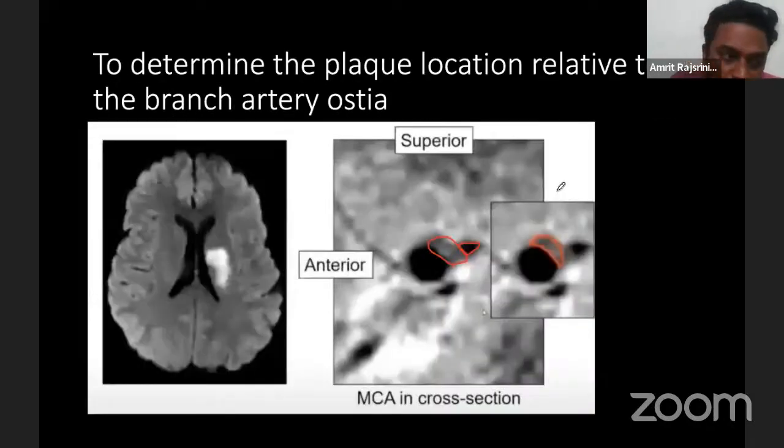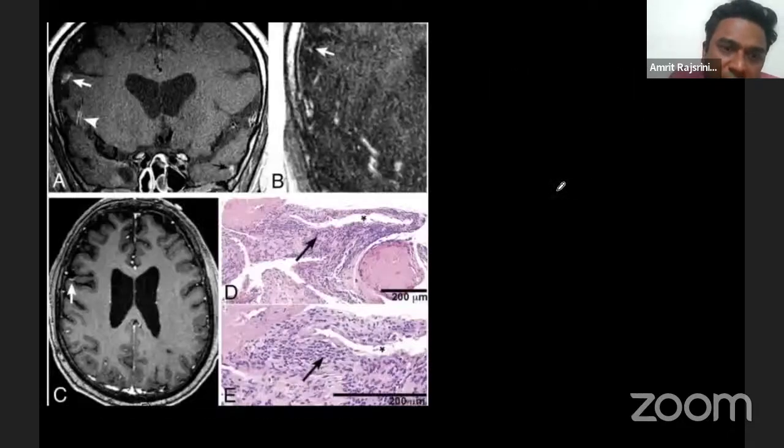And we have started doing whole brain vessel wall imaging. In the 3D vessel wall MRI, you can get the whole brain sequencing. And if you're able to do that, then if you see some enhancement, usually, as you said, vasculitis, then targeting your biopsy to that part of the tissue can improve the yield. I think in one study, nearly 70–80% yield was there. There's only one study, I think, which came with whole brain vessel wall MRI.